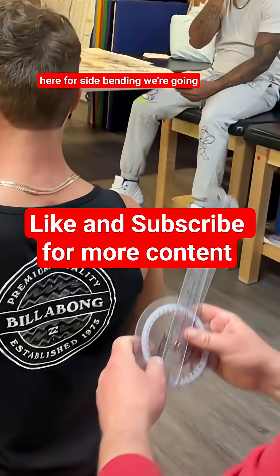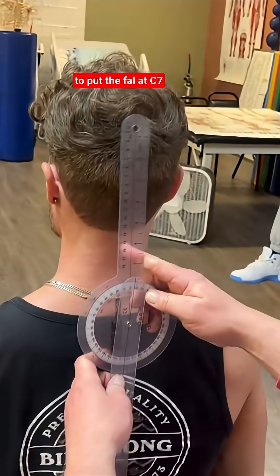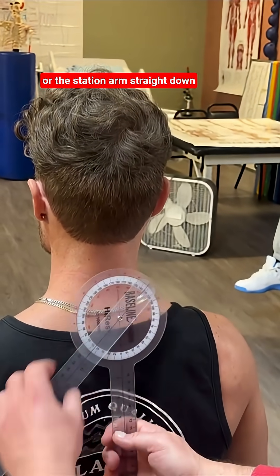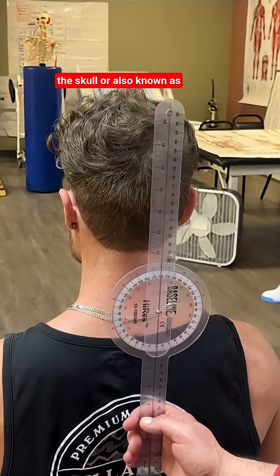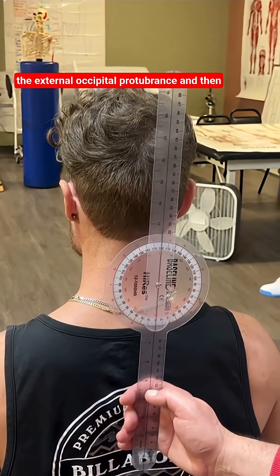If we go back here for side bending, we're going to put the fulcrum at C7. Then we're going to have the stationary arm straight down the spine. Moving arm goes to the center of the skull, also known as the external occipital protuberance.